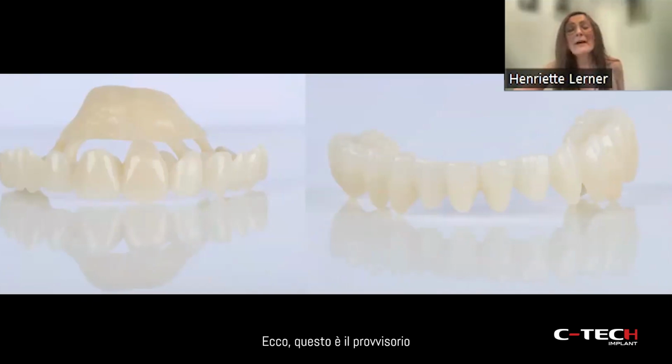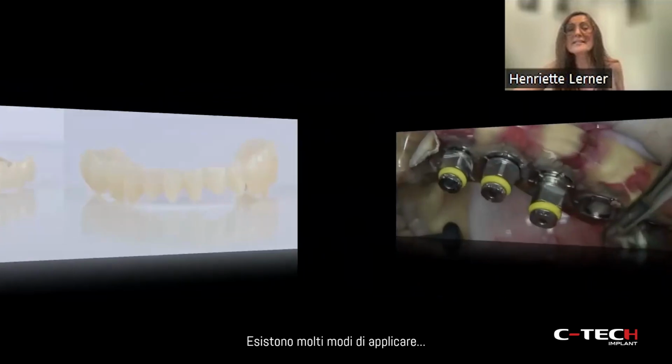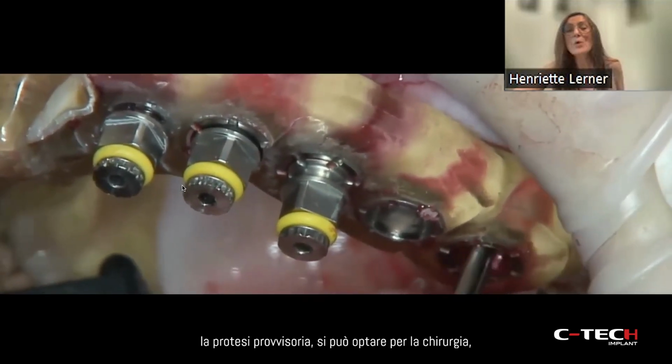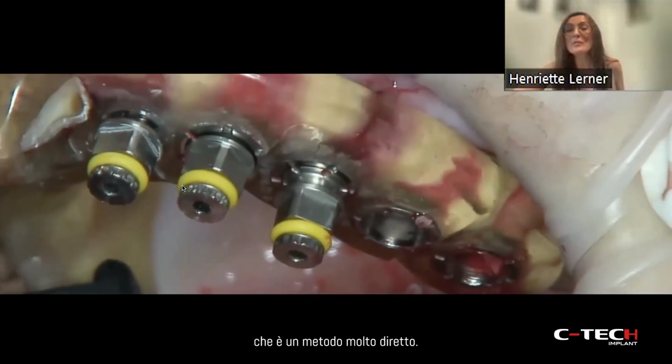So now this is the provisional, and the provisional you can apply on the palate with that kind of palatal plate. There are many ways to fix the provisional also, and you can go for the surgery, which is really straightforward.